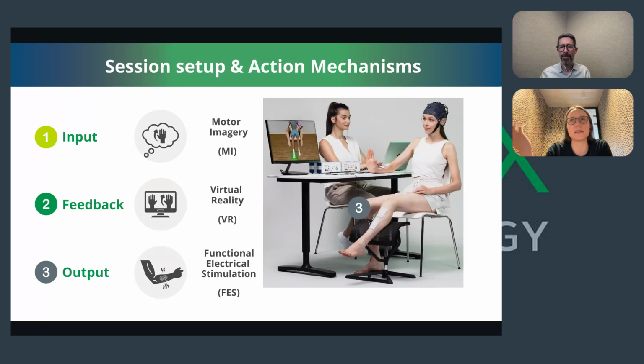They have been damaged by the stroke or the brain injury, and so the pathway is kind of broken. So that's what we want to put together again, when the brain puts the commands to do the movement happen, either from the patient's help or with the stimulation. We see so many people that have seen physios and other functional and occupational therapy professionals to help with that limb that isn't really doing what it's supposed to do or what the patient wants it to do.